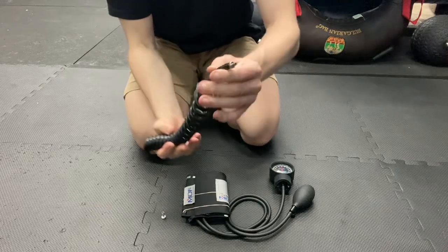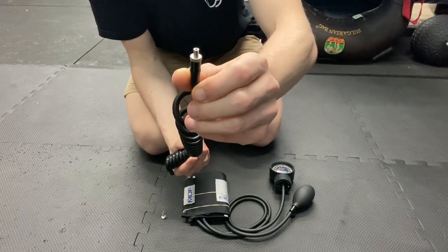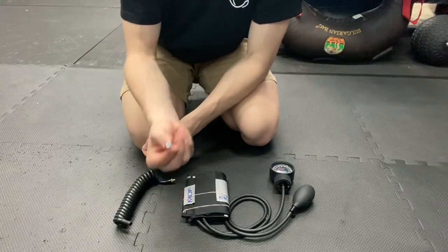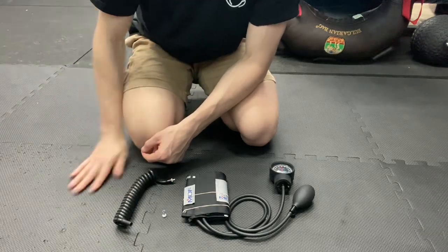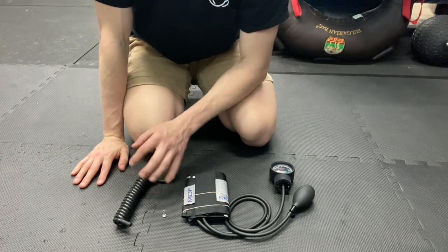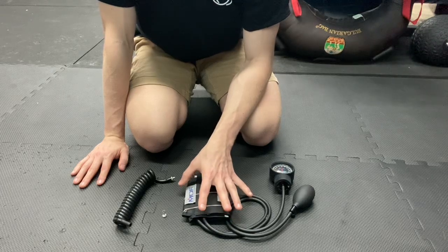A lot of times they will come with the male Luer connector. That's what you're looking for, L-U-E-R. You want one of these with a male Luer connector. And then you also want to get a female Luer connector, which I have, again, linked on my website. Both of these I have from the same website, so you just need to go to the website, add these to your cart, and then get your blood pressure cuff separately.